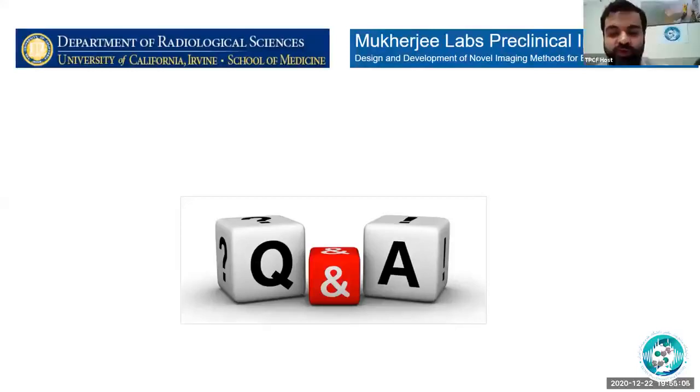Cool, thank you very much. There's another question that came out. They're referring to the fact that you've used FDG, and that's glucose imaging. How did you control for the exercise or physical activities of the subjects before actually performing the scan? How did you normalize them? With regards to animal handling, maybe they could have some FDG uptake as well in the IBAT area.